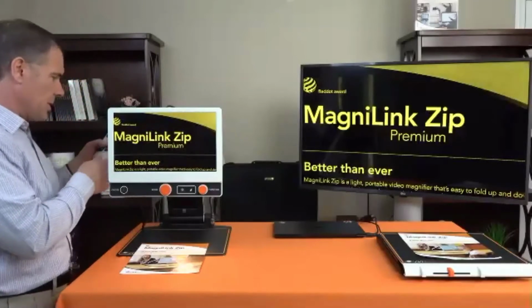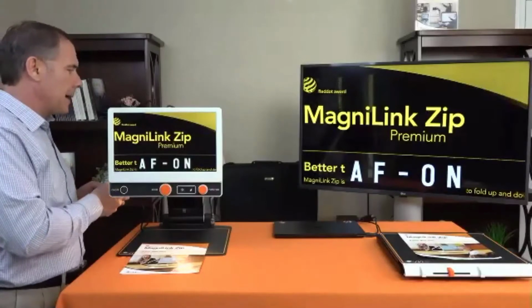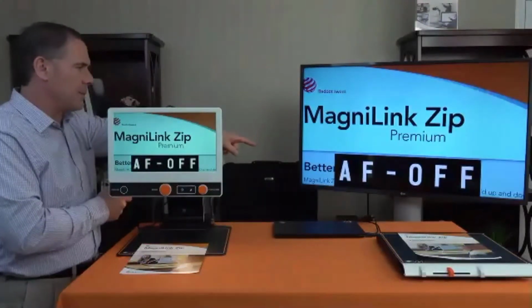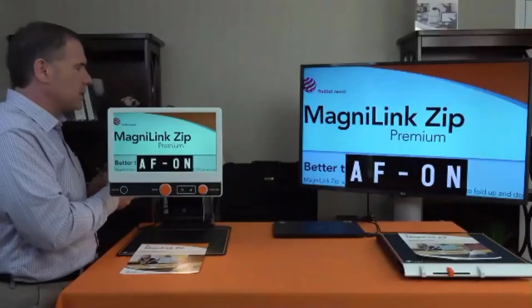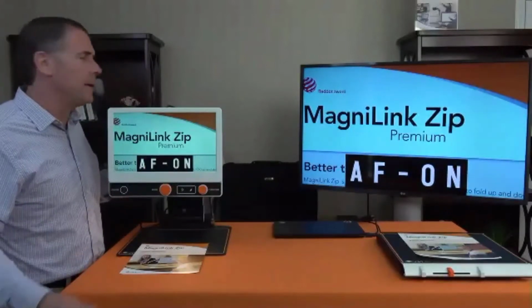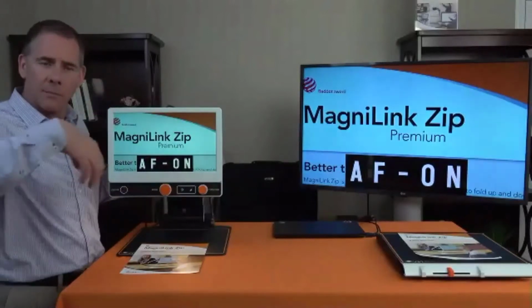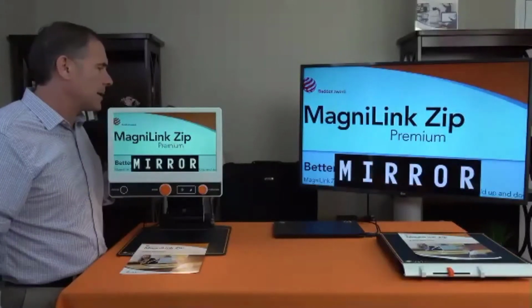So I'm just going to show you if I had the menu here. Now you see, I'm going to put it in color mode so you can see that better, but it has a nice large print and I can turn the menu on. That's autofocus. Now I'm going to just go through what's inside the menu. I'm not going to dive into each one, but we can turn autofocus on and off. That might be if I'm doing a lot of hand work. I don't want to try to focus on my wrist, just on what I'm working on. Turn it off. Next one is mirror mode.